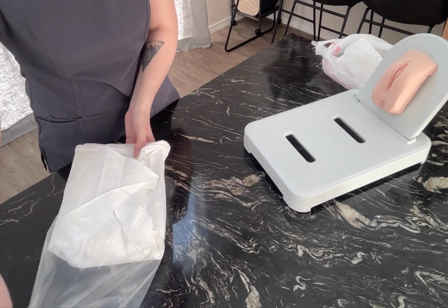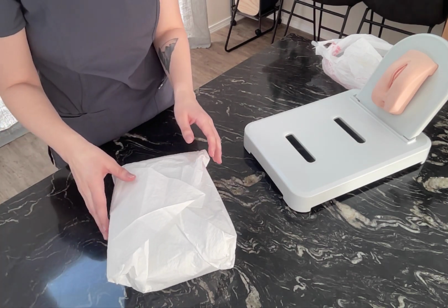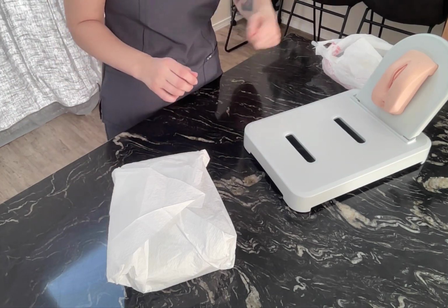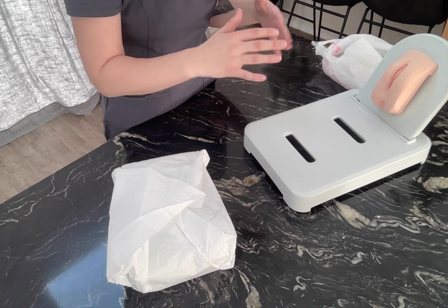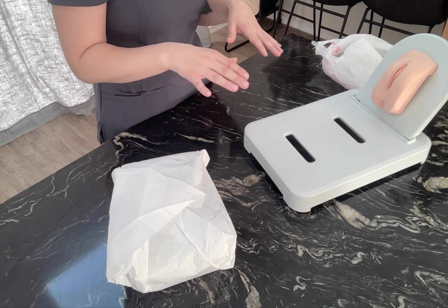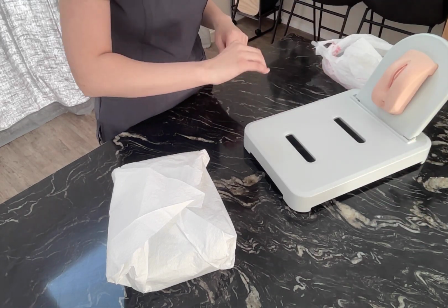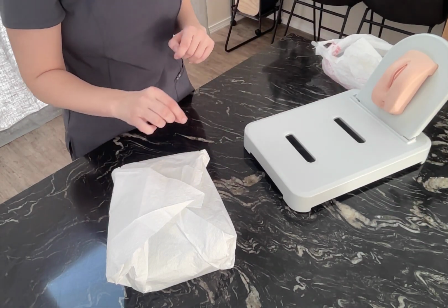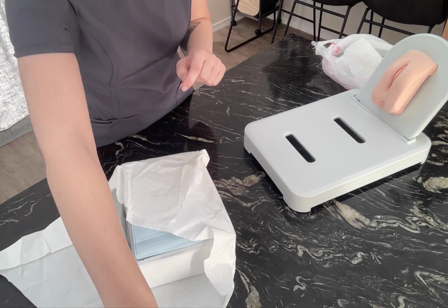All right, I went and I got my supplies. All right, Mrs. Smith, I'm gonna pull the drape back, and we're gonna open the sterile kit. Please ensure that you don't close your legs or touch anything in the sterile field. So I'll have you bend your knees and just relax your thighs. All right, Mrs. Smith did that. I'm gonna go ahead and open the kit now, maintaining my 1-inch border.